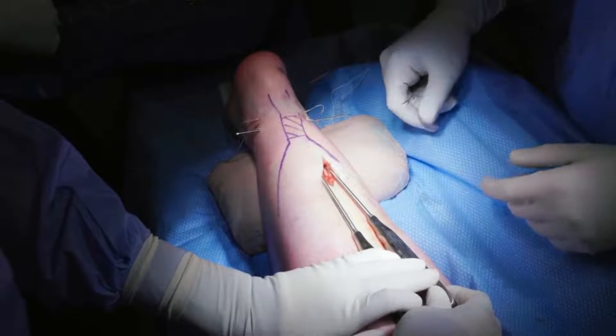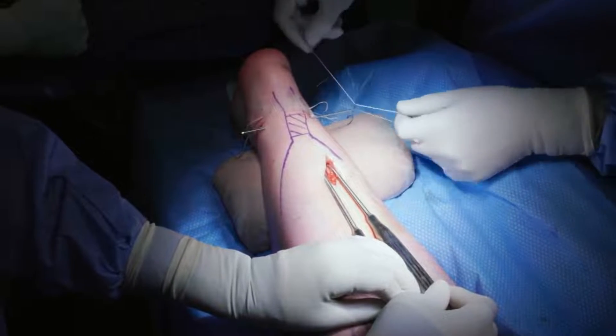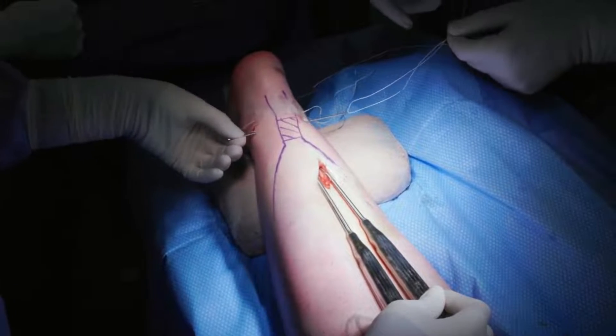The ends are arranged such that the looped ends of the two threads are placed opposite one another, with one resting on the medial side and the other resting on the lateral side of the tendon.